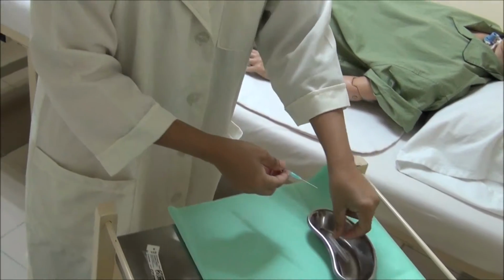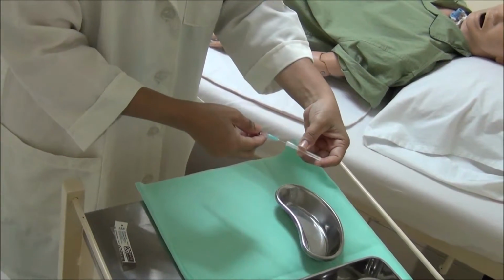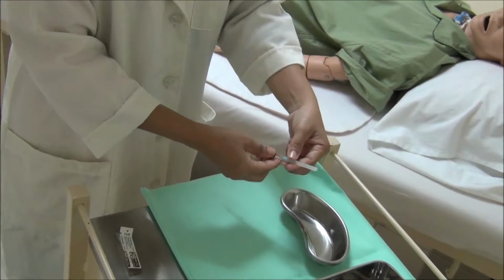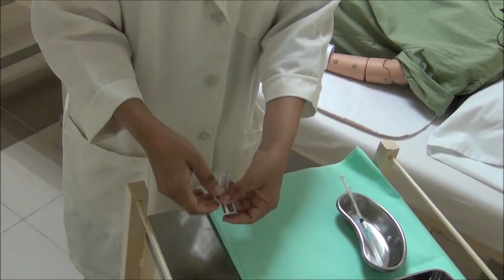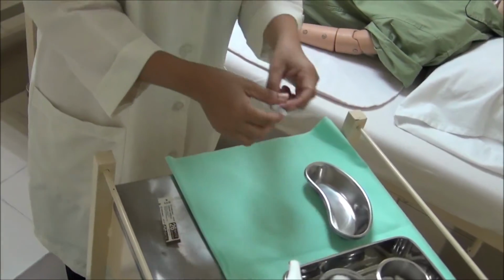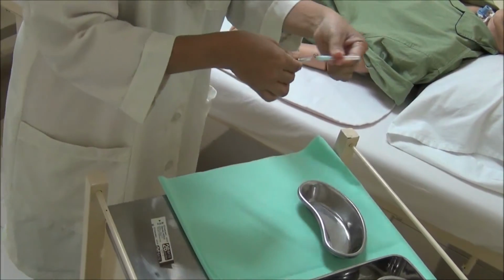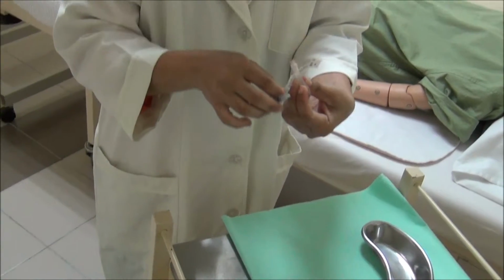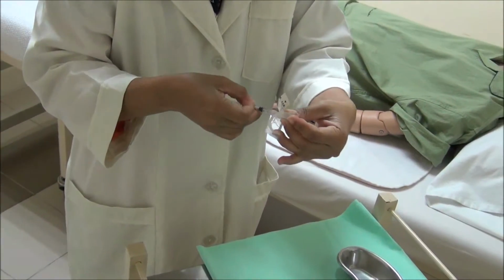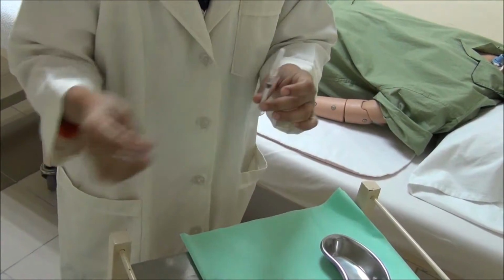Recheck amount of medication in syringe. Remove the needle and the syringe from the vial. Pull the plunger back slightly. Remove the withdrawing needle from the syringe and discard into the sharp bin. Attach a new needle, 26 gauge also.